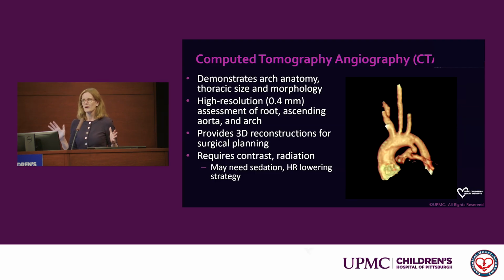So there's a wide variety of tools available, and there's a wide variety of strategies available. If anyone ever wants to talk CT strategy, we're happy to do it, and we look forward to learning from those of you who have great strategies at your institutions. Suffice to say, there's a lot here, and I'm happy to chat more if people have questions during the panel. But the overall goal is, using the gentlest imaging strategy possible, to get a really pristine and measurable picture of the aortic root, subaortic region, and then ascending aorta.